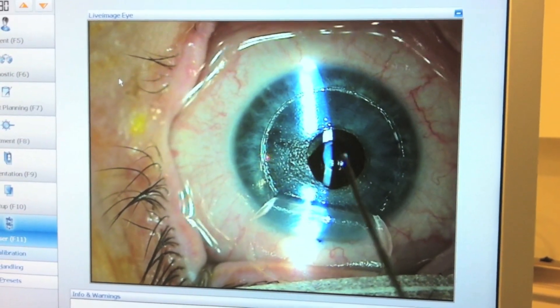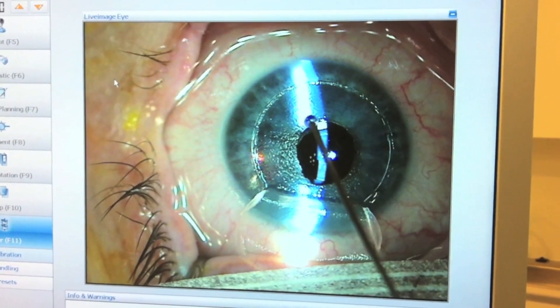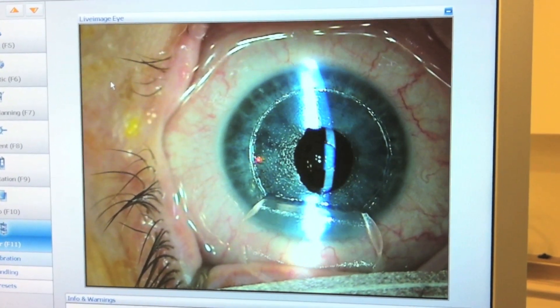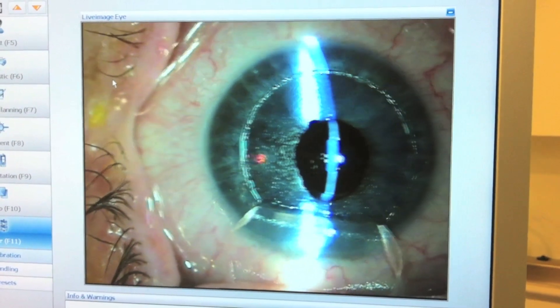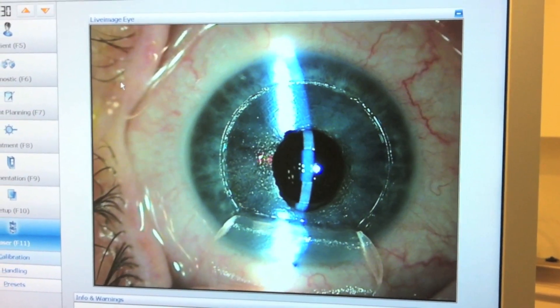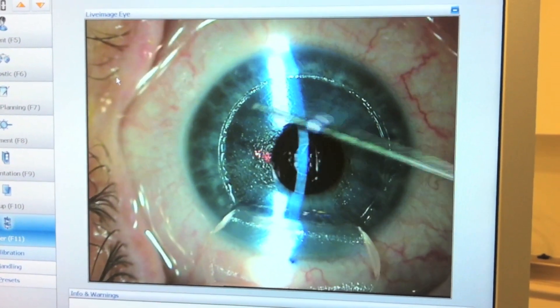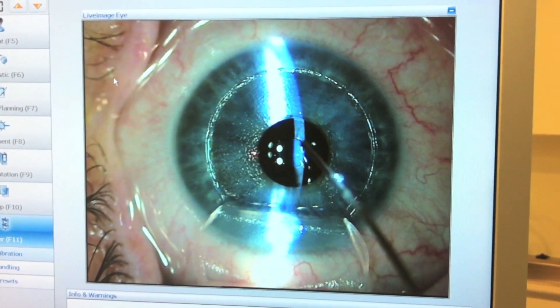A drop of BSS is placed on the inlay to free it from the stromal surface. Knowing how the inlay needs to be moved both in terms of distance and direction, find a landmark on the stroma to help with this maneuver. Gently push it to the required position, after ensuring that the inlay is wet and can move.